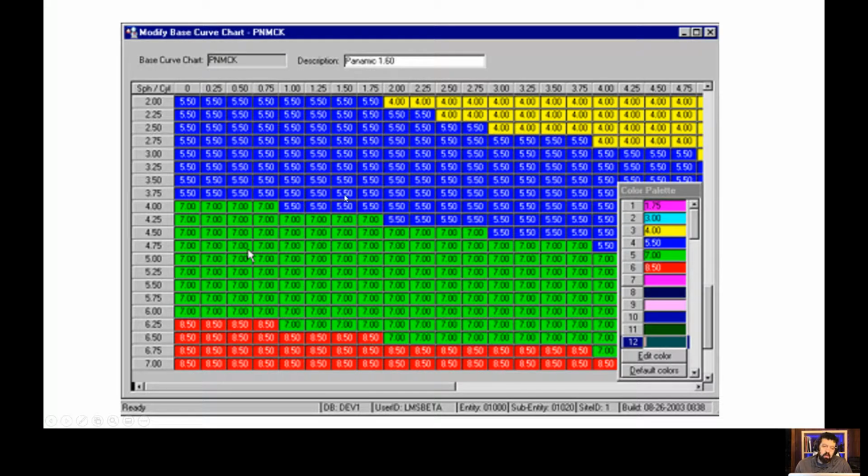But if it doesn't work and you feel that the base curve is altered enough and the prescription has not, that's when I would start looking at, hey, do I want to go back to a closer or similar base curve to what they were wearing? But if I went from a spherical CR39 to an aspheric polycarbonate, it may not be appropriate to match the base curve because the lens design is not warranted.